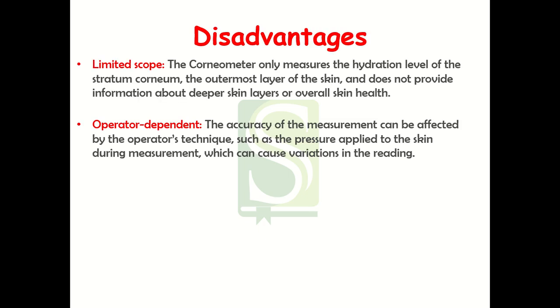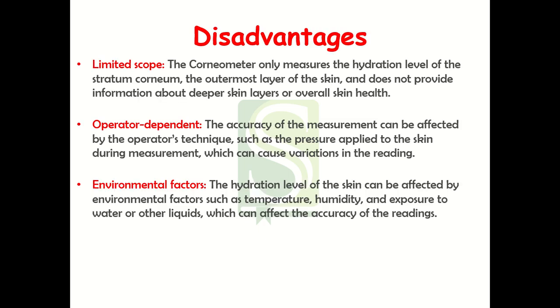Now, what are the disadvantages? It has limited scope. It measures the hydration level of the stratum corneum, which is the outermost layer. It does not give you insights about the deeper layers of your skin, and hence you do not know the overall health of your skin. Also, the accuracy of the measurements is operator dependent: what technique the operator is using, how much pressure is applied on the skin, etc.